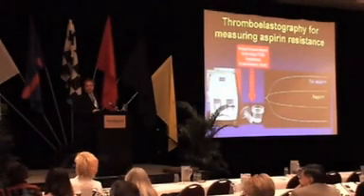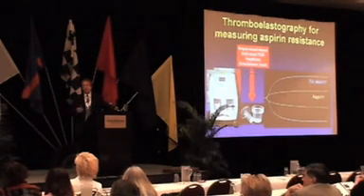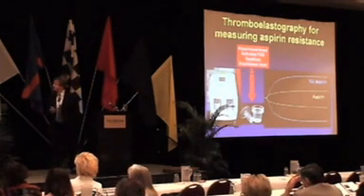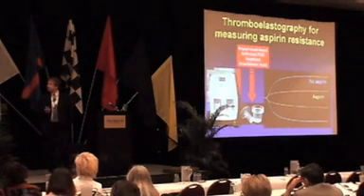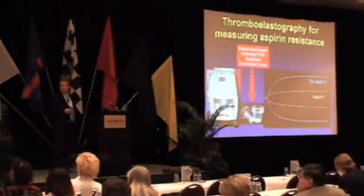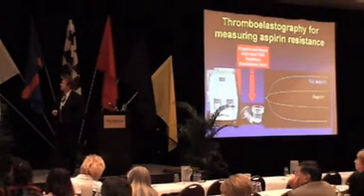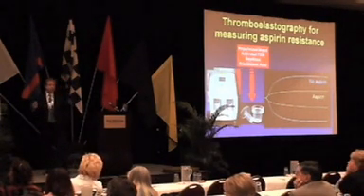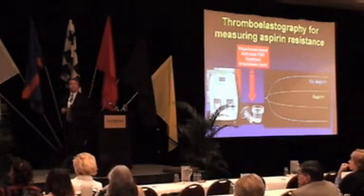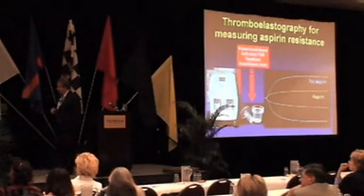Now, thromboelastography is an interesting technique because it's so flexible, and it can be used to measure all sorts of different things. It can actually be used to give you an indication of aspirin resistance. In this particular iteration of the thromboelastograph assay, activation of blood coagulation is done in the presence of heparin, and then with a cocktail of activated factor 13, reptilase, which I'm sure many of you are familiar with. Reptilase is a snake venom which cleaves only fibrinopeptide A and is insensitive to the presence of heparin. And then platelets are activated by arachidonic acid.